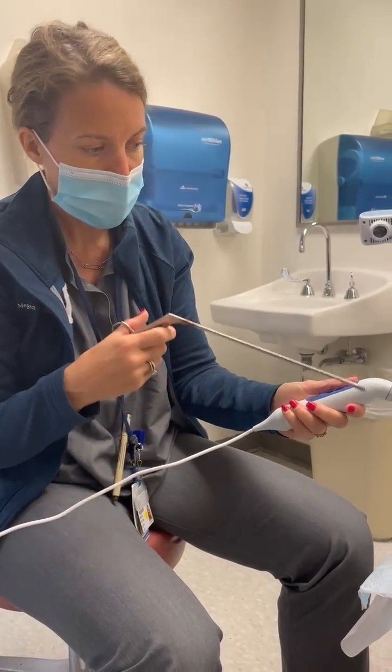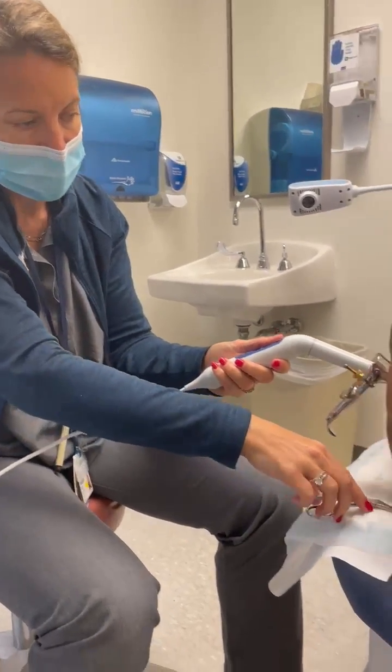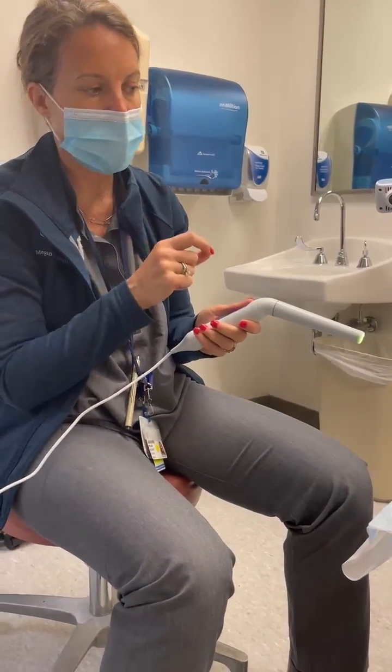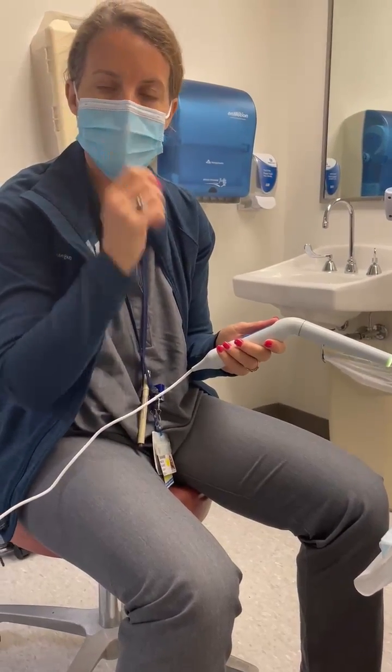At that point I generally remove the pocket and can do my hemostatic techniques with the pocket out of the cervix.